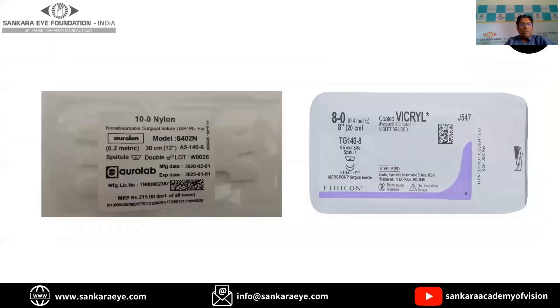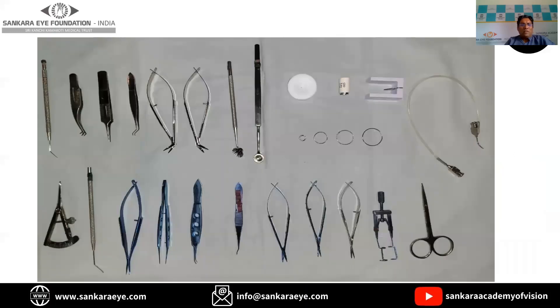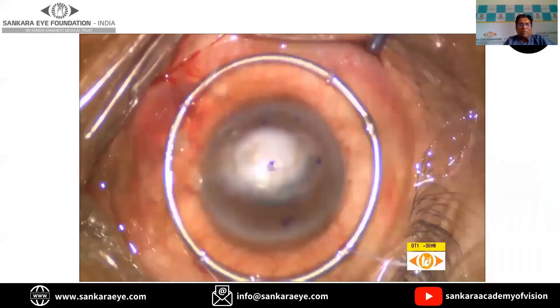This is the suturing instrument, a needle holder, and straight tying forceps used for the suturing process. The most commonly used sutures during penetrating keratoplasty are the 10-0 monofilament nylon sutures. They are preferred because of ease of placement and because they maintain their strength for a long period of time. The 8-0 Vicryl sutures are mainly used to anchor the ring on the episclera.